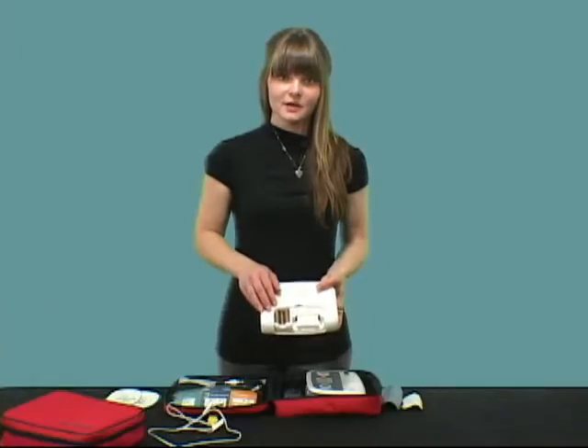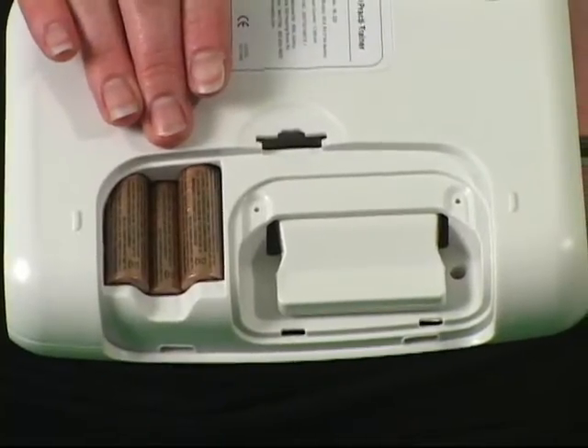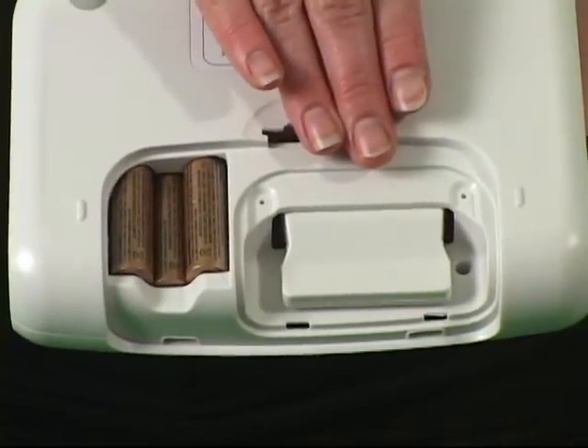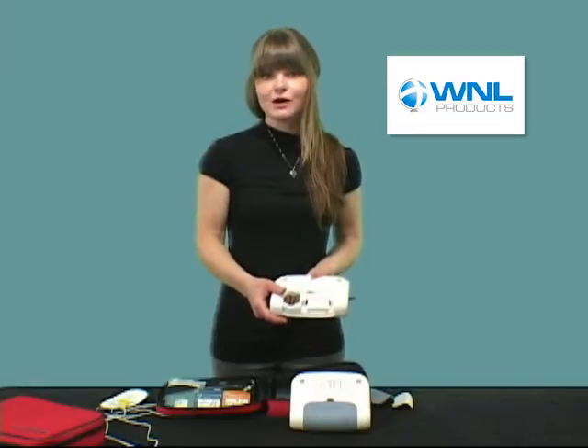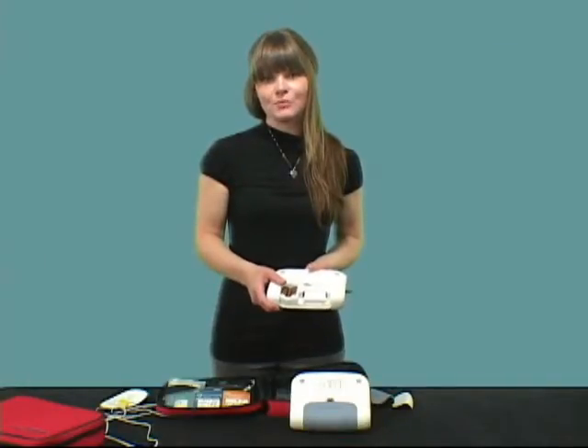On the back is the compartment for the batteries and the language scenario module. The PractiTrainer holds two different languages. Language modules come in many different language combinations.